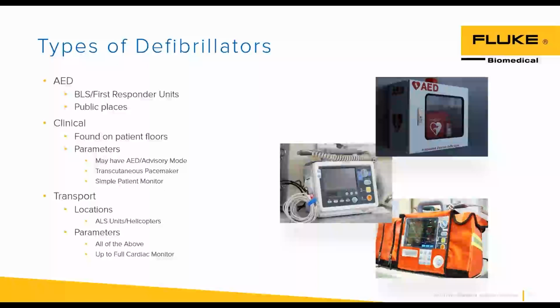And some of these defibs, we put these in three nice little classifications, but there's some bleed over in between them. A lot of these clinical defibrillators will have an AED mode or an advisory mode in them. Some of the ALS units are the same way, where you can function as an AED and then switch it over.